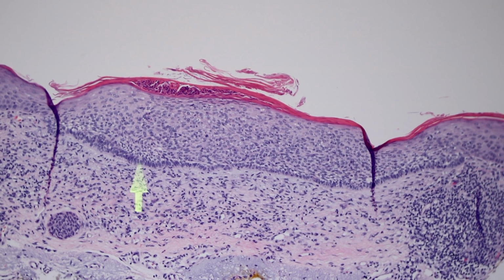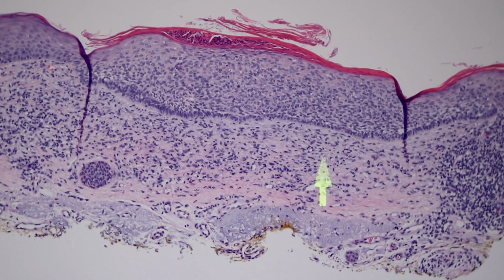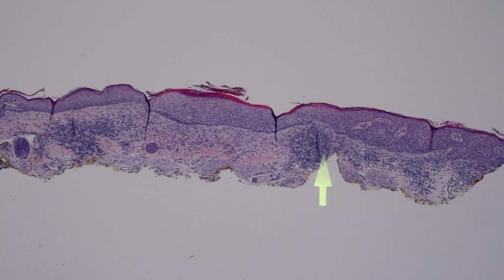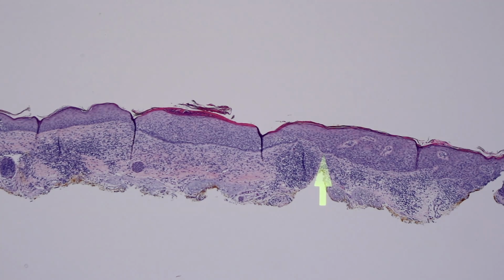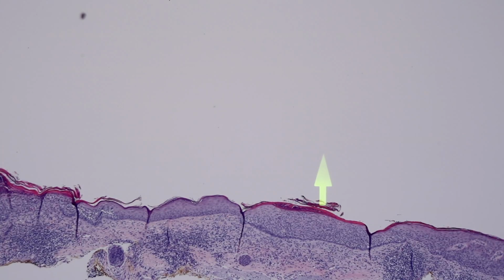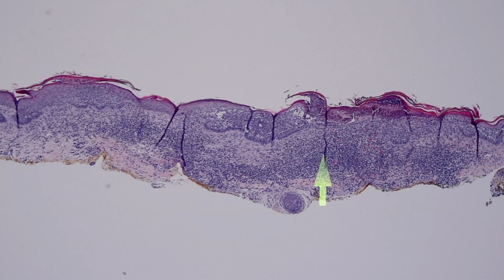This little bit of basaloid cells can look kind of like the jumbled atypia at the base in an actinic keratosis. So the one thing that helps me a lot is the stroma underneath. There's this unique fibrotic and slightly myxoid stroma that basals tend to make, and I find that really helpful. And again, it probably doesn't hugely matter for patient care because squamous in situ and superficial basal cell often get treated similarly. Not always, but often the distinction is not of huge importance, but I think it's still good conceptually to understand.